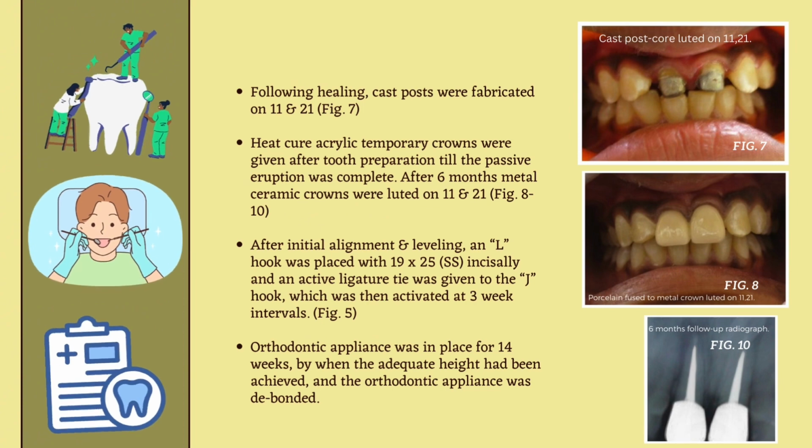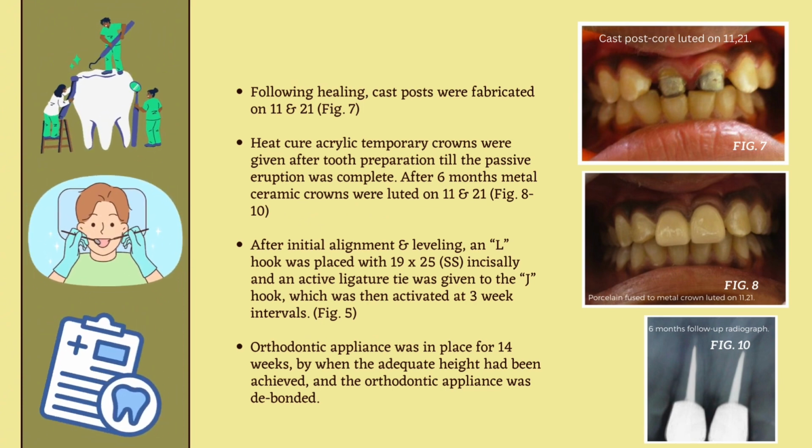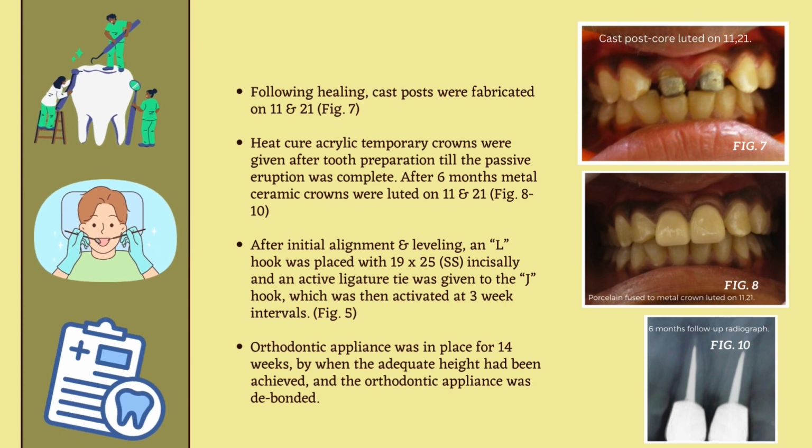Fig. 7. Heat cure acrylic temporary crowns were given after tooth preparation till the passive eruption was complete. After 6 months, metal ceramic crowns were luted on 11 and 21.